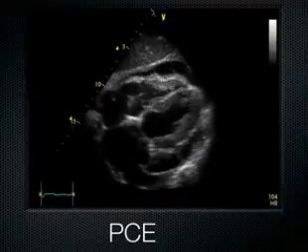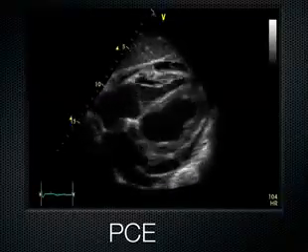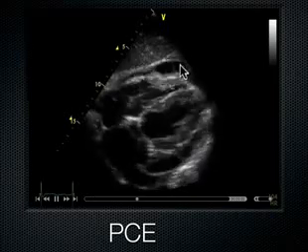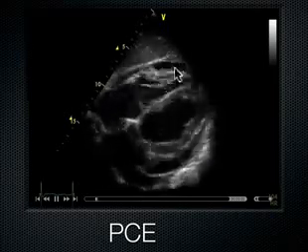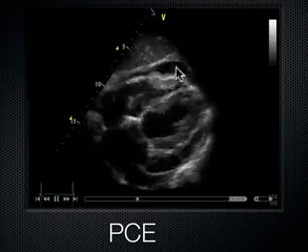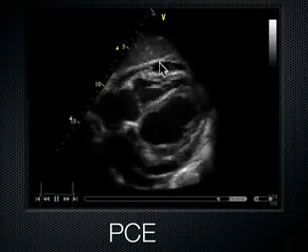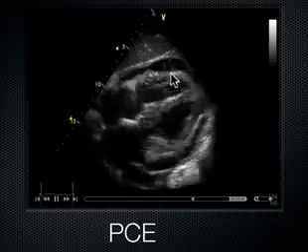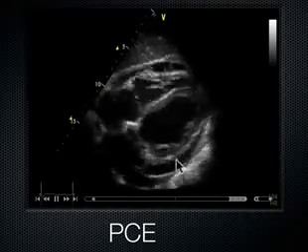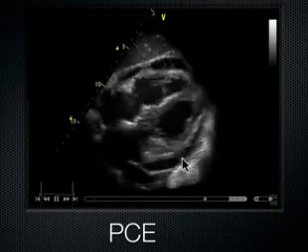Here's a smaller one here, and actually people are always asking me about this one. I'll just point out the reason I get questioned about it, because people see this right here. They see this little material in the pericardial space, and they say, what is that stuff in there? And I say, I don't know. I don't really care. I know that there is a pretty good sized stripe here, more than a centimeter, and in fact it stretches to go around posteriorly as well around this patient's heart. So that's a little bit concerning.